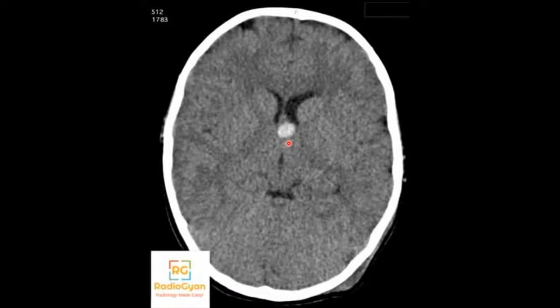Another important thing that you have to remember is that on FLAIR images, you will not be able to appreciate these lesions. So make sure that you go through your T1 weighted sequences really carefully. What happens is that T1 we tend to ignore in a lot of body systems, but trust me, if you can ask for one sequence for any pathology, that is T1. Not only do you see the anatomy really well, but you'll be able to make out that there is some pathology. You may not be able to distinguish what is it and what is causing it, but T1 is excellent in delineating pathology. So make sure that you look at your T1 sequences carefully.